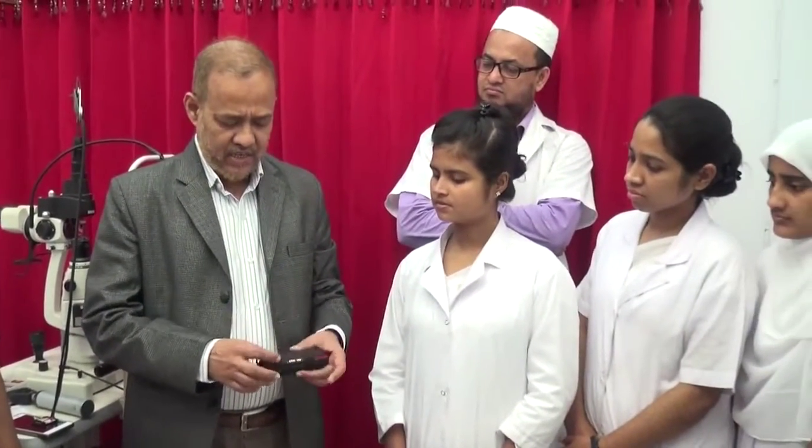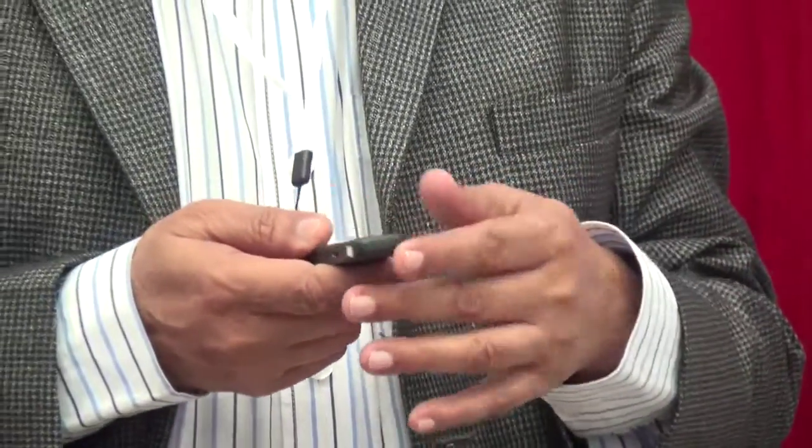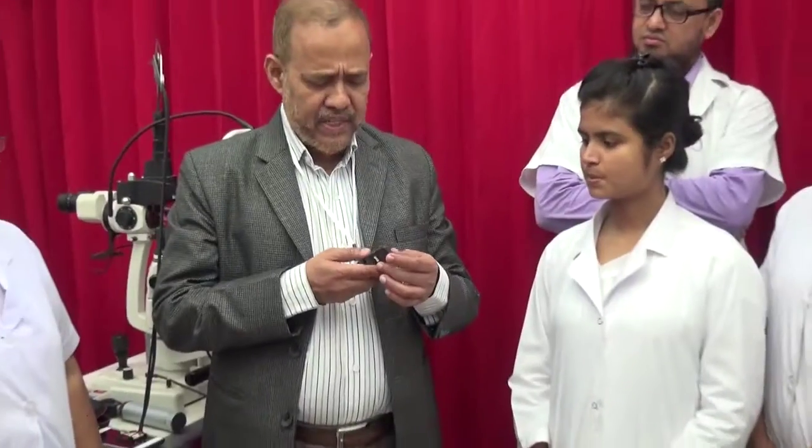Now I am going to present this equipment known as ArcLight. This is the ArcLight inside this box. With this equipment we can use it to see the retina, we can use it as a loupe to see the external area of the eye, and we can use it to see the ear as an otoscope. The advantages of this equipment are many.